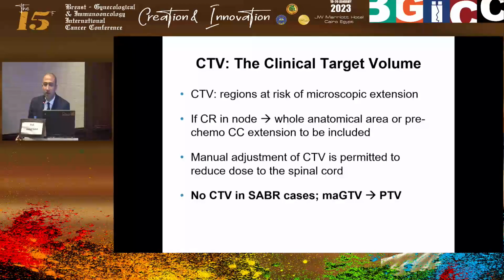Thank you very much. So in our practice, obviously, the craniocaudal extent of the nodal disease we always include. The primary, in the rare situations, I think I've only seen 2 cases where the primary in the lung has completely responded. And we always debate these cases. We never know the answer. If there's completely nothing in the lung, you can't even see any faint change within the lung tissue, you are no longer sure where you're hitting. So we don't tend to treat these. But if there is some change, irrespective of how small it is, I would always err on the side of caution and treat that area.